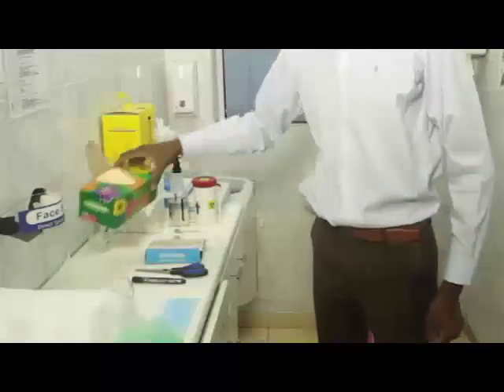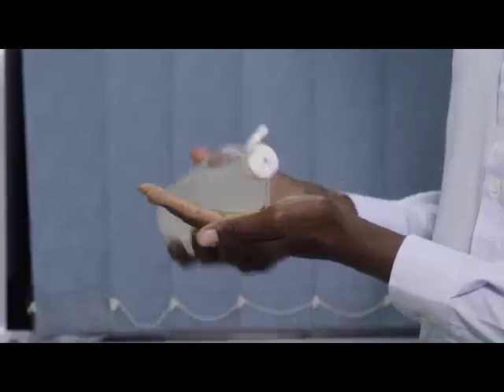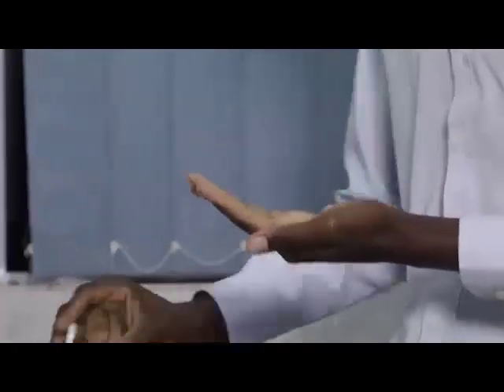Nine, tissues. Ten, tongue depressor. Eleven, biosafety bag. Twelve, soap and water or alcohol-based sanitiser.